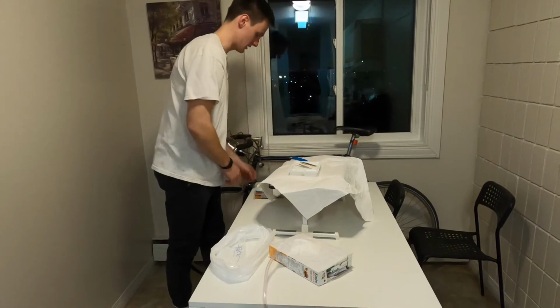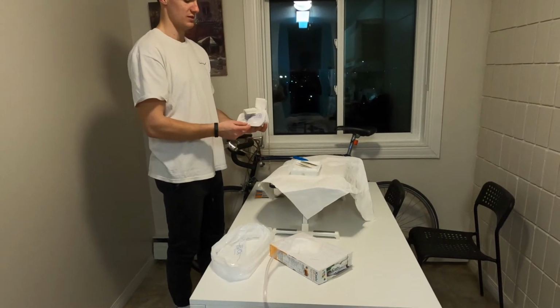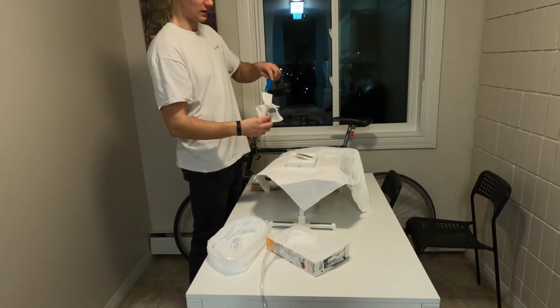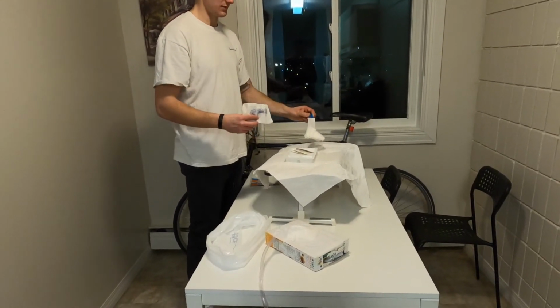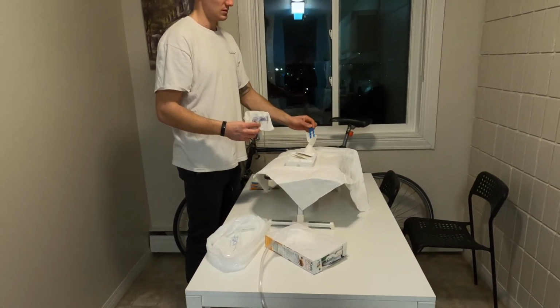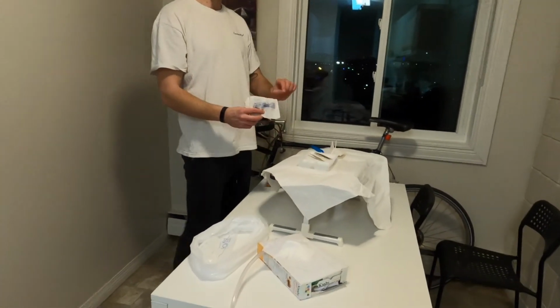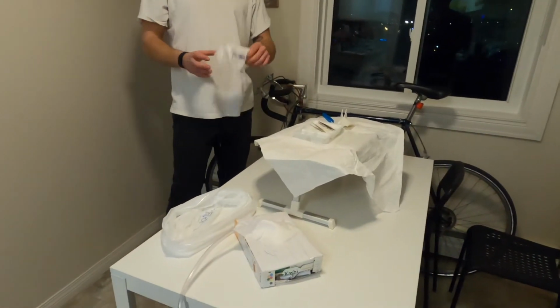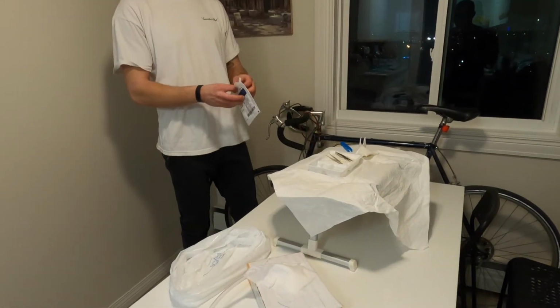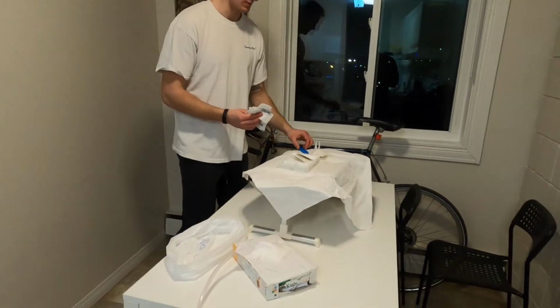And then I'm going to add my IV compresses or my IV drain sponges. Making sure when I wing it back that the parts I've touched don't go back onto the gauze itself there. So, it's stuck there. So it kind of grazed the corner as I was taking it off. It was still the inside of the gauze or the package. In practice, I'd probably just ask for a new package just to be sure.